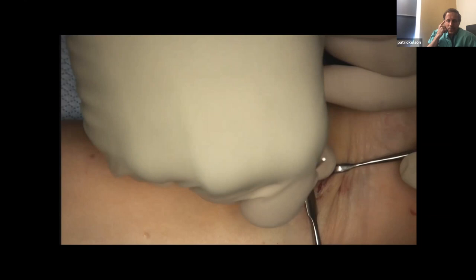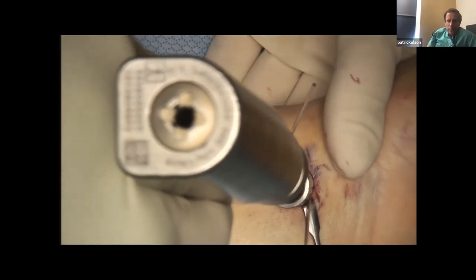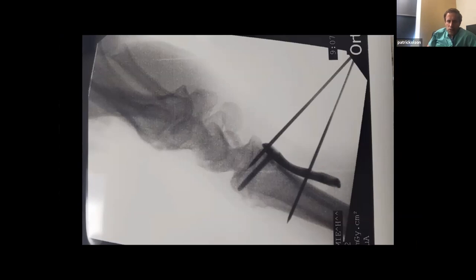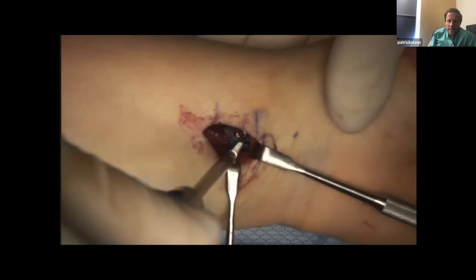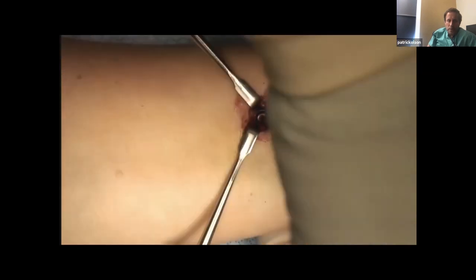You do have to work in a tight space. This is the variable angle guide — it basically fills up the entire incision. If you need to get the plate just a little bit distal, use the variable angle guide. The standard fixed angle guide is a lot smaller. Here are intraop pictures — you can see I've got distal fixation with the plate off the bone proximally. Now I do the liftoff technique to bring it down to the bone and recreate that volar tilt of the distal radius. Here's the kickstand screw.